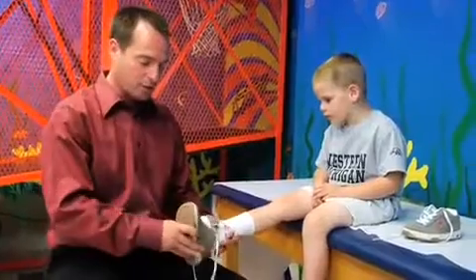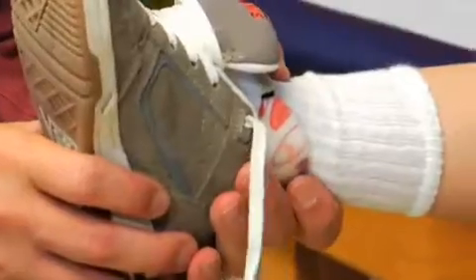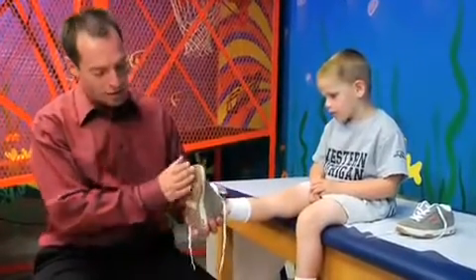After the SureSteps are properly fit, we want to make sure that the footwear will go over them without a lot of problems for parents. The best way to do that is to slip the foot into the shoe and do a twisting motion to slide the orthosis into the shoe. Generally, children shouldn't need to go up to a bigger size as long as they have a shoe with a nice flat plantar surface and a broad rounded toe box.